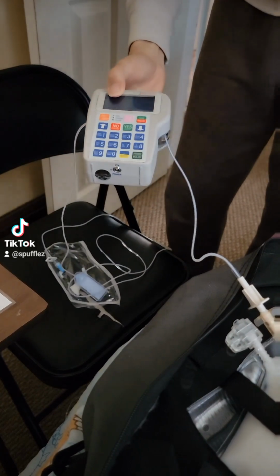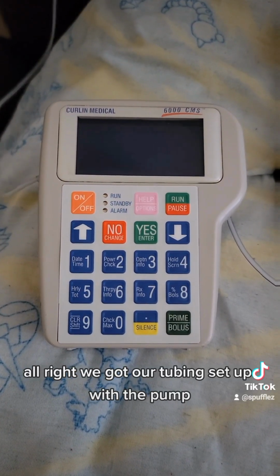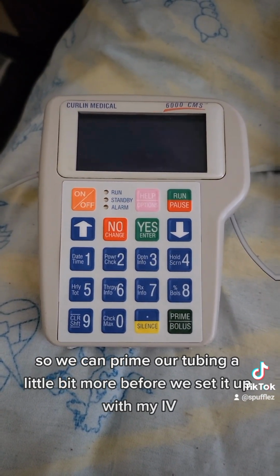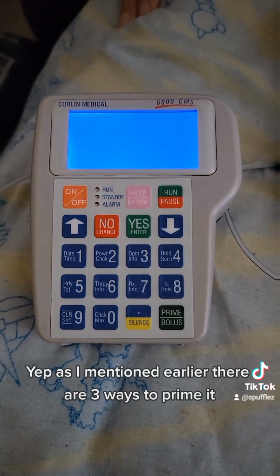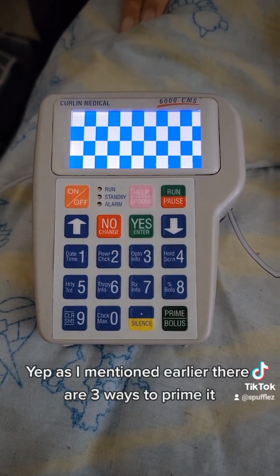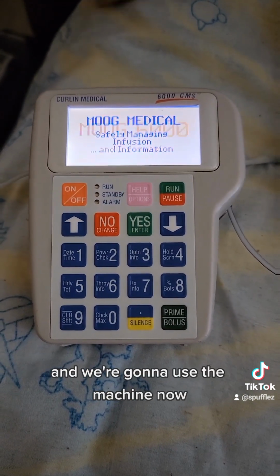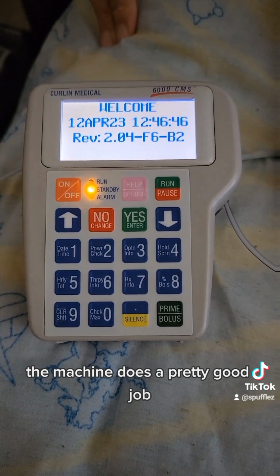There you go. All right, we got our tubing set up with the pump so we can prime our tubing a little bit more before we set it up with my IV. As I mentioned earlier, there are three ways to prime it. Really, just two, using gravity and using the machine, and we're gonna use the machine now. The machine does a pretty good job.